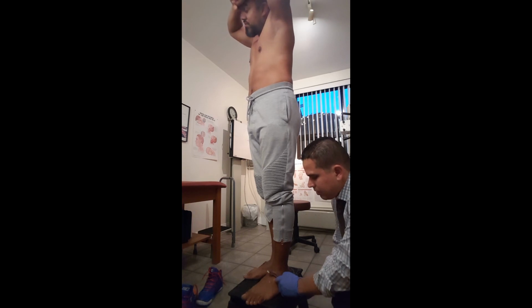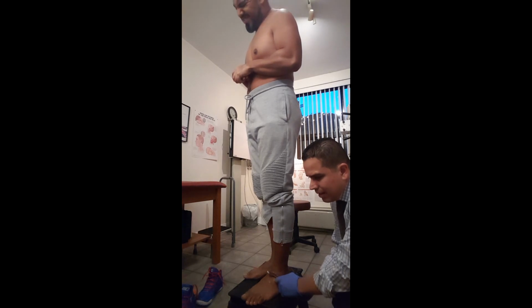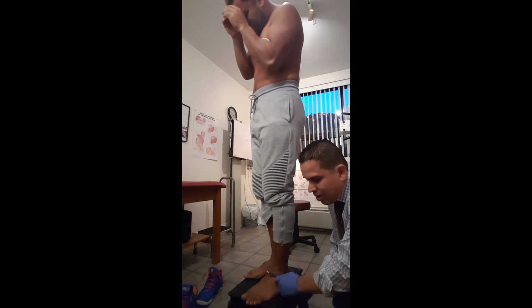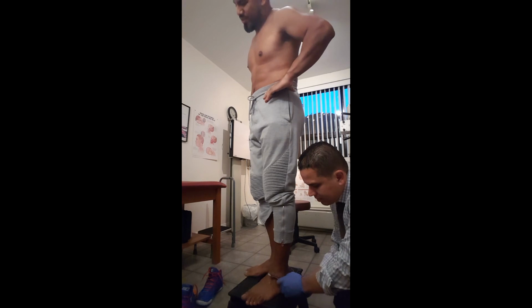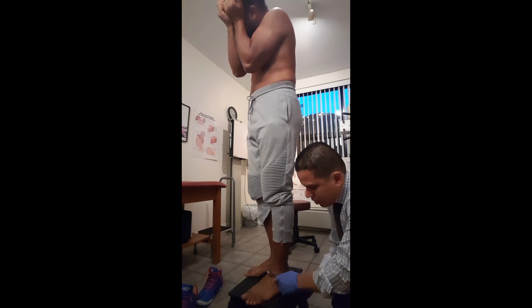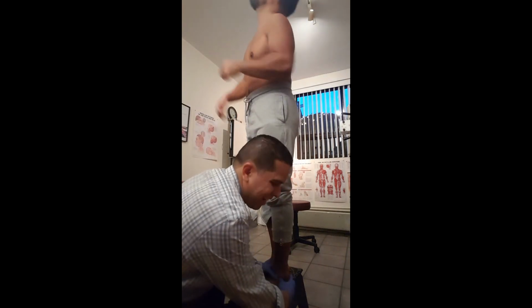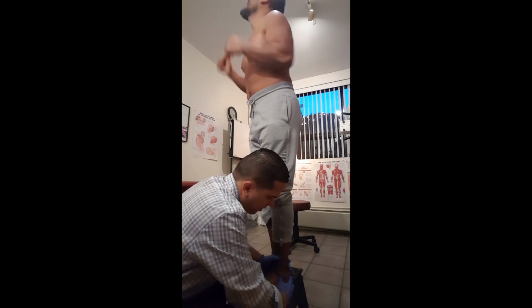Let me apply more pressure there. Now I'm purposely applying the pressure, very tiny spot right there. And he's starting to sing his opera. Oh, yes, it's right there, doctor. All right, so now we need to treat this with some pressure. All right, so let me turn around. And we gotta get really, yes, it's right there, doctor. Oh my God. Okay.